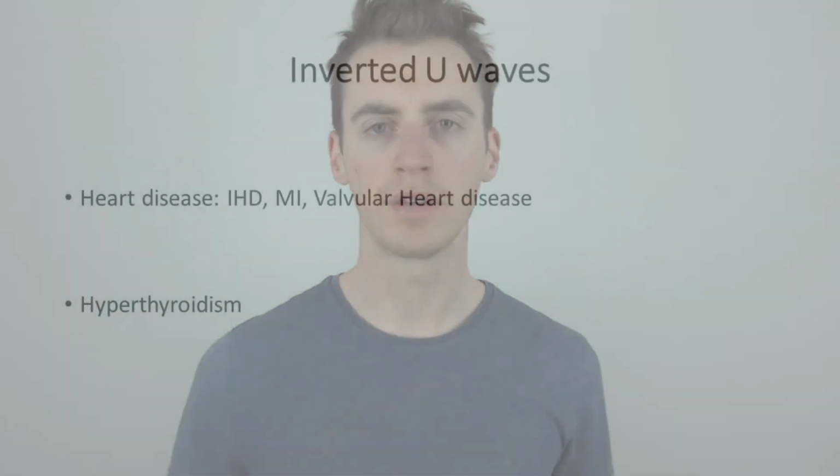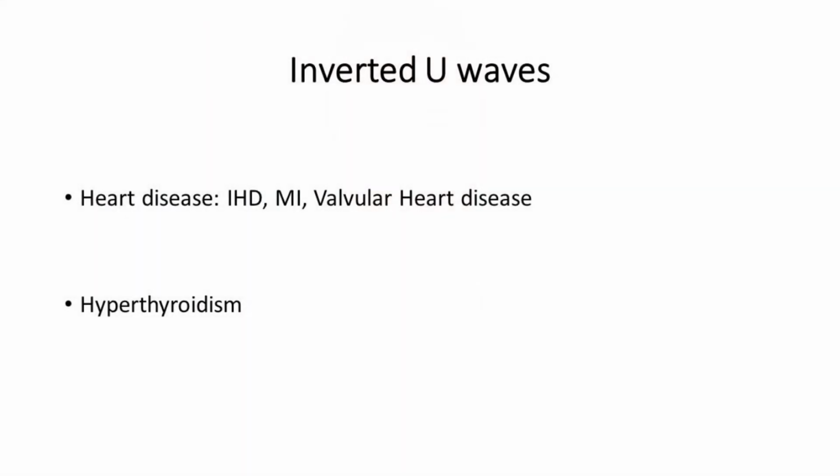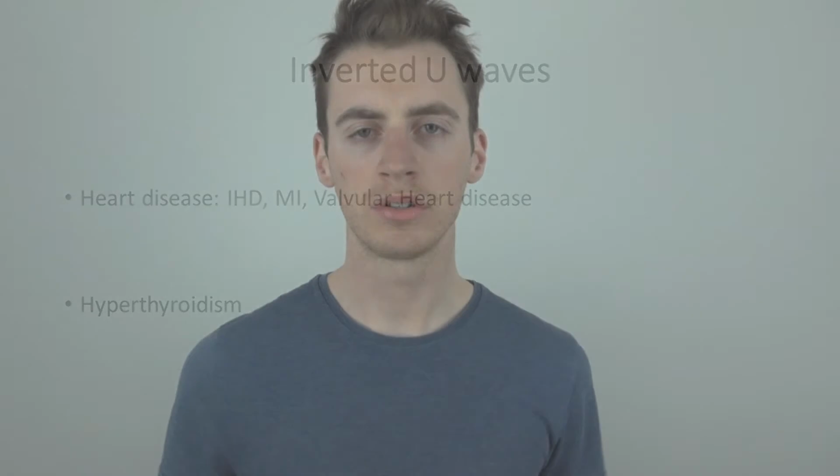Inverted U waves are a sign of myocardial ischemia or infarction. So they're associated with coronary artery disease of some accord. So that sums up U waves.